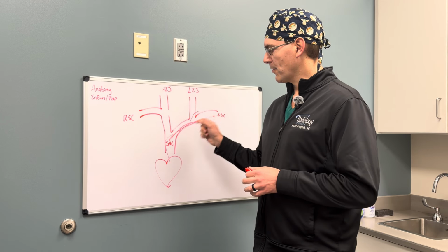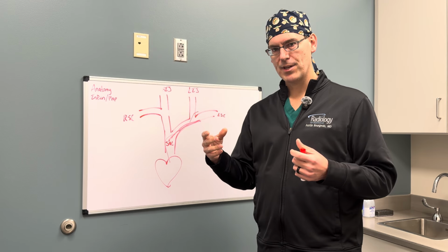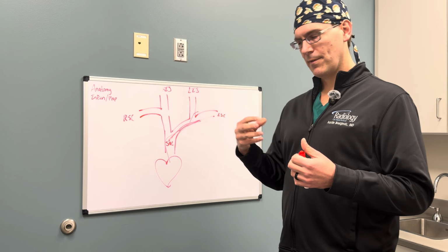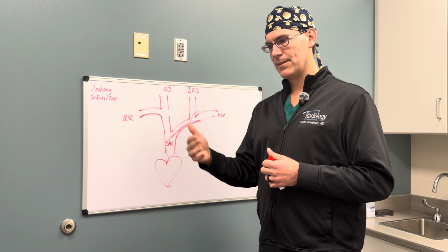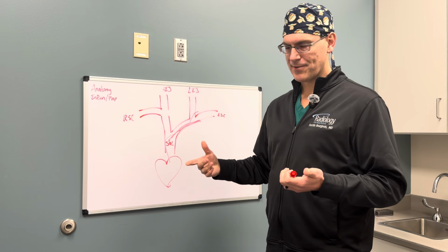Similarly, prolonged contact with the vein can accelerate the development of a fibrin sheath, which is, again, a sleeve of tissue that forms along the tip of catheters. It's less likely to occur when that catheter tip is in a mobile location, like in the right atrium.